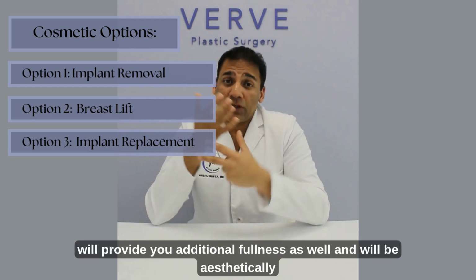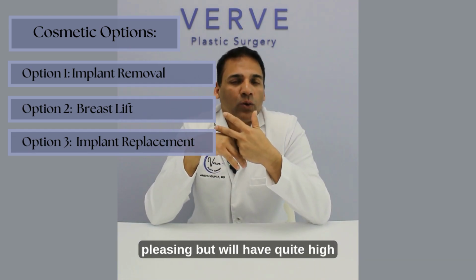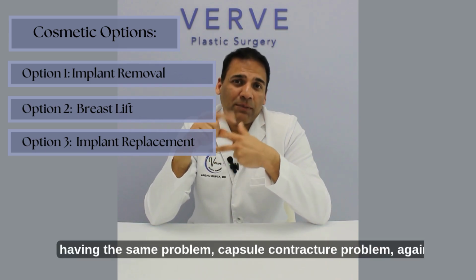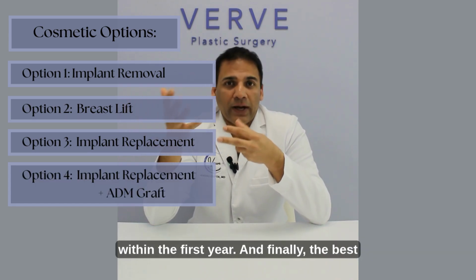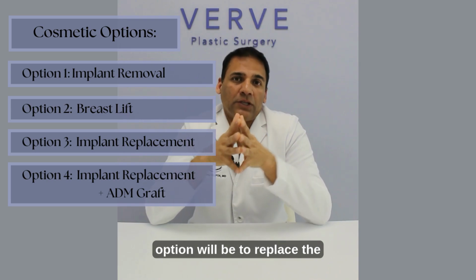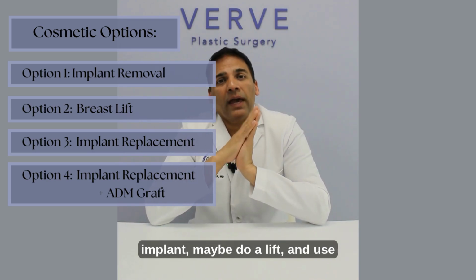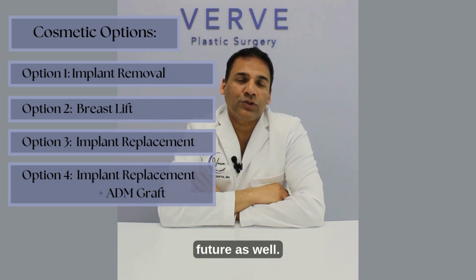That will provide you additional fullness as well and will be aesthetically pleasing, but will have quite a high incidence, about a 1 in 3 chance of having the same capsule contracture problem again within the first year. And finally, the best option will be to replace the implant, maybe do a lift, and use the graft to prevent this from happening in the future as well.